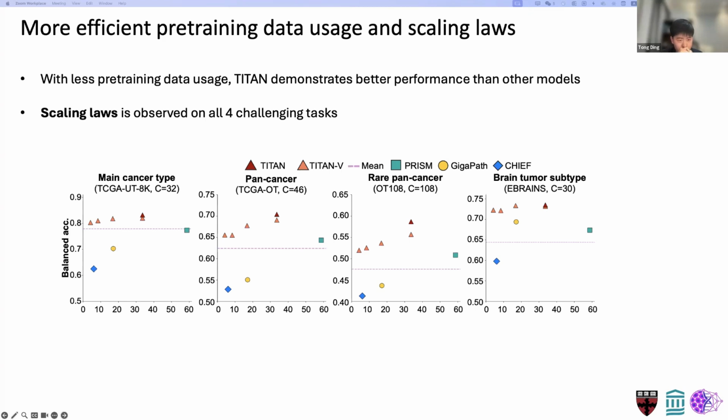I would say, first of all, the field of slide foundation models is not currently as popular as the patch level foundation model domain, where we probably have more than 50 patch level foundation models already. In the field of slide foundation models, many of the methods are still early efforts. And many of the previous models like GigaPath or Chief were actually not designed for linear probing use.